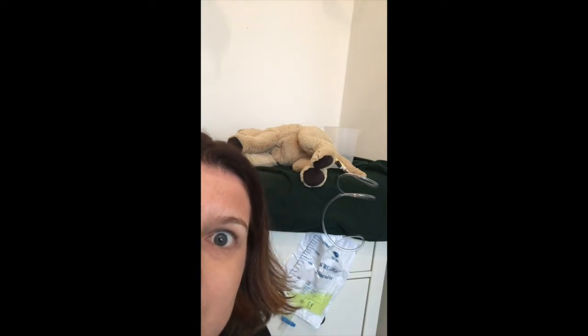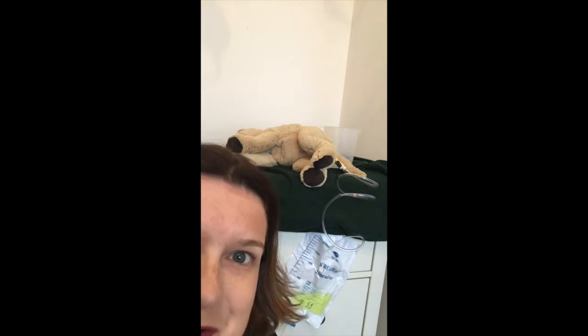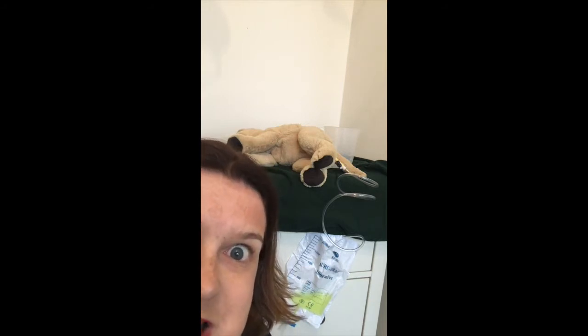First thing I need to say is I haven't got any aprons, so I'm going to mock up an apron by wearing a gown. Don't have a panic that you have to be sterile for this — it's purely so that I can demonstrate getting rid of any waste at the end.